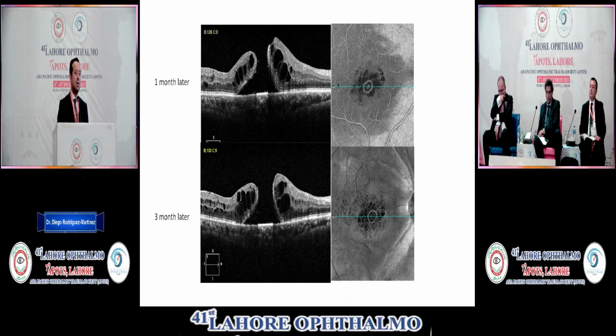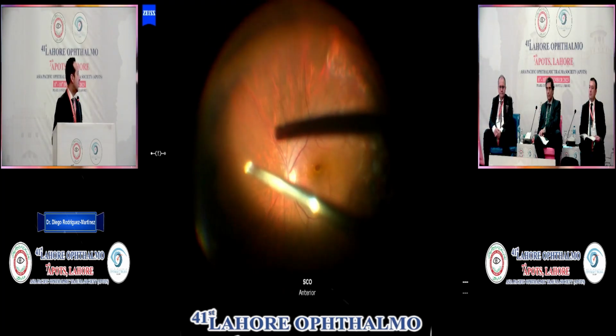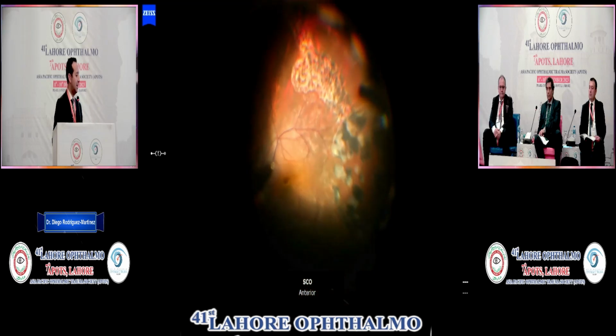And he said to me, there have been too many surgeries, I don't want another surgery, is there any medical treatment I can do? So we put him on topical steroids and non-steroids, and came back later. He came to me 3 months later, and you see the hole remains almost the same. So here's the surgery. You can see the laser on the anterior retina.